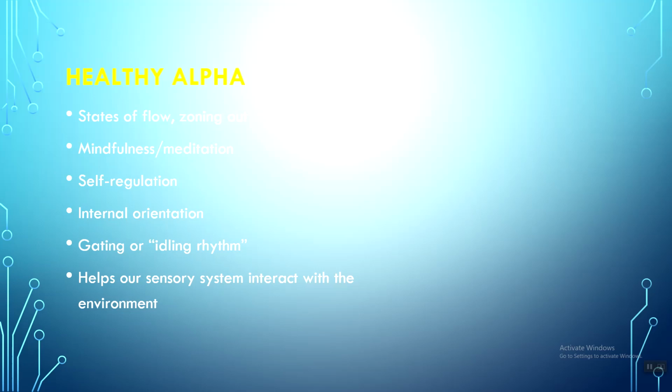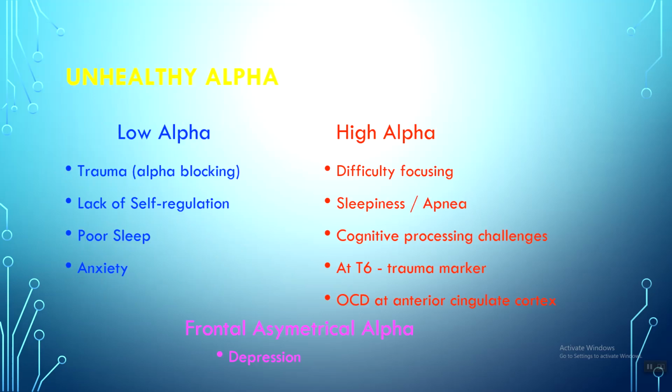When alpha goes very fast, like 13, 14, it's very difficult to maintain stability. How high it is is different than how fast it is. Yep, and that's one of the big pieces of this lecture: size and speed. They get confused a lot when people say, oh, my alpha's too fast, as opposed to too big.